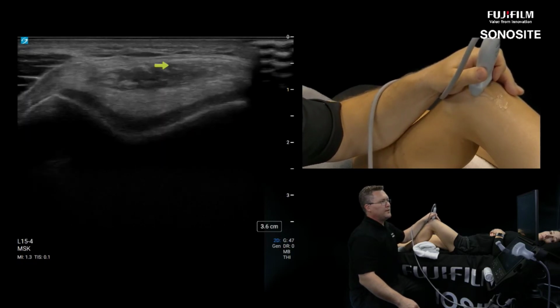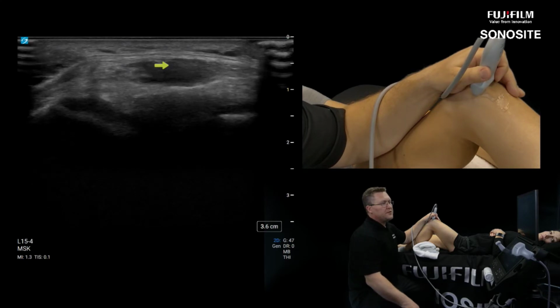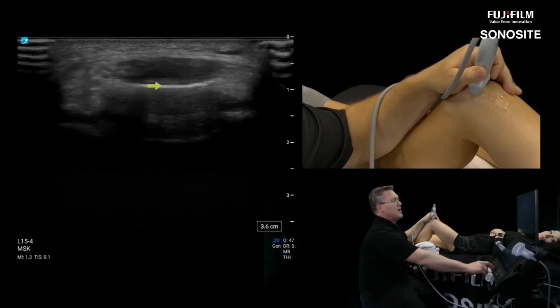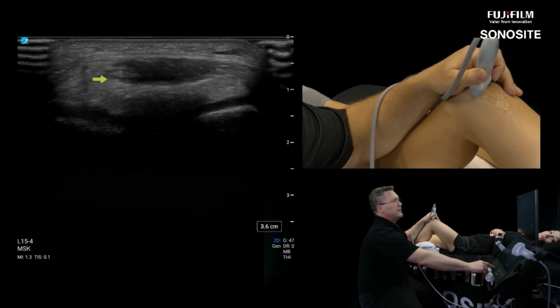Because once the tendons lose their linear, longitudinally arranged fibrillar appearance and they start to blend in a homogeneous way that's dark and hypoechoic and diffuse, that's when tendon disease is easy to pick up. So nice healthy quadriceps tendon here. It's this oval. Here's the fat pad underneath it, the quadriceps fat pad.